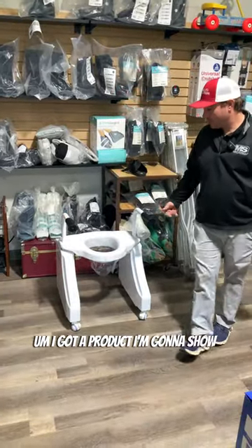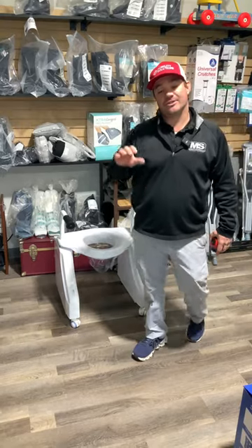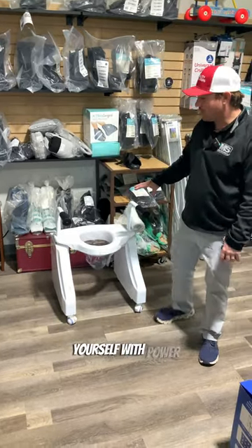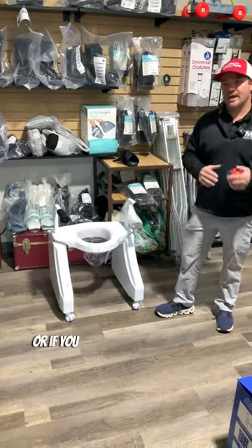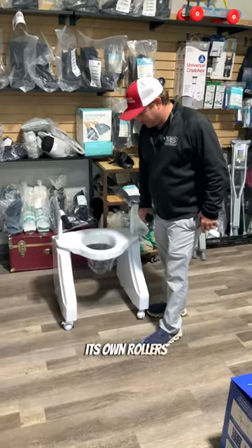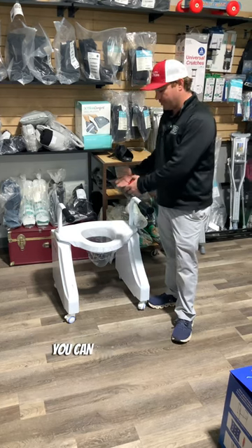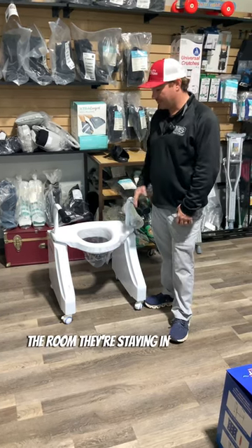I've got a product to show you if you need some help getting on and off the toilet yourself with power, or if you have a family member that comes and visits you. This is something you can roll — it has its own rollers. You can put it over in a closet when someone comes, put it over the toilet in the room they're staying in or the bathroom they're using.